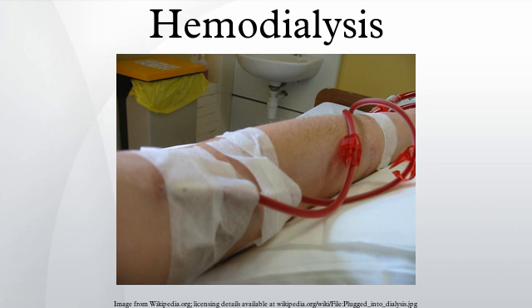After World War II ended, Kolff donated the 5 dialyzers he had made to hospitals around the world, including Mount Sinai Hospital, New York. Kolff gave a set of blueprints for his hemodialysis machine to George Thorne at the Peter Bent Brigham Hospital in Boston. This led to the manufacture of the next generation of Kolff's dialyzer, a stainless steel Kolff-Brigham dialysis machine.